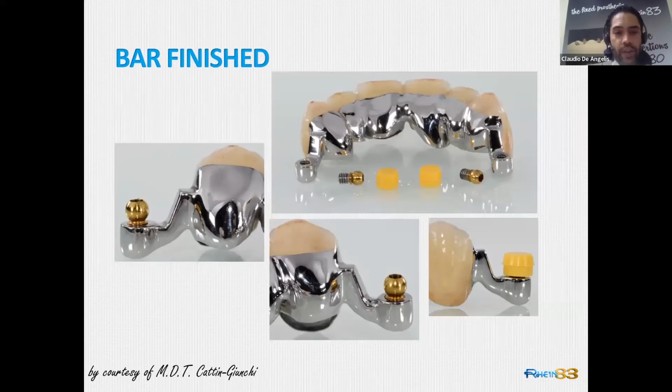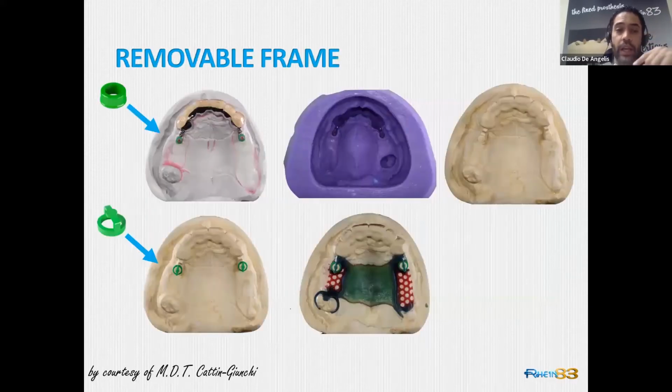And when everything was approved by the dentist and by the patient, they produced the aesthetic coverage. Please appreciate also the finishing of the structure, but always keeping safe the arm. So everything should be made with a logical workflow, okay? After that, they duplicate the model as I showed you before.